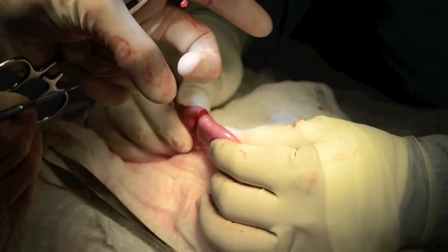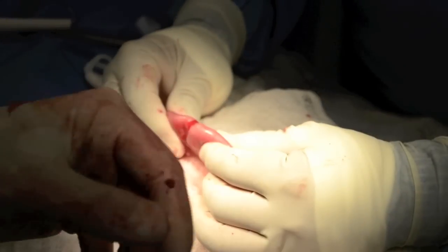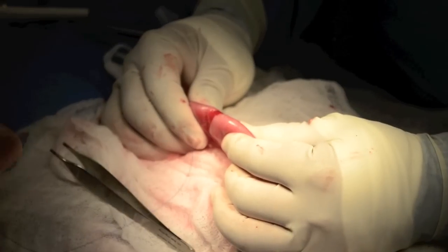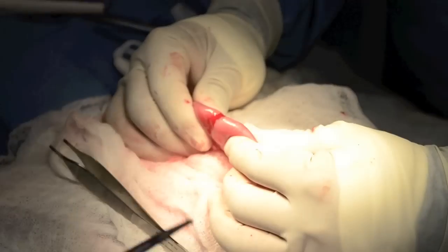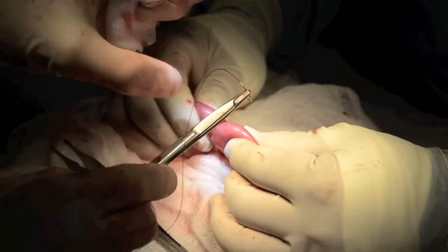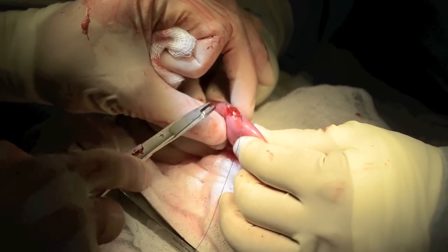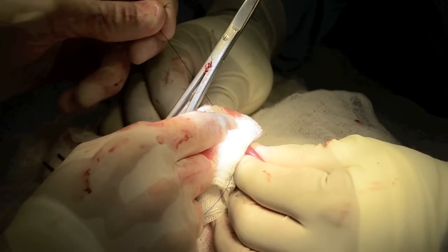Be sure to include mucosa. The resultant defect can then usually be closed with two or up to three sutures in a larger dog, using three or four zero PDS or similar.